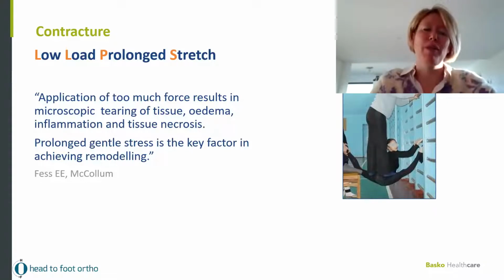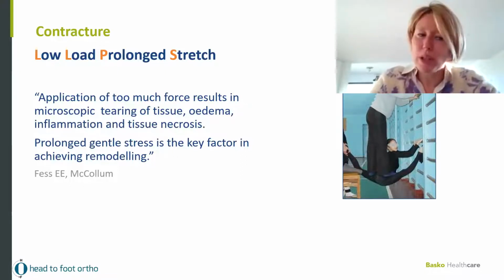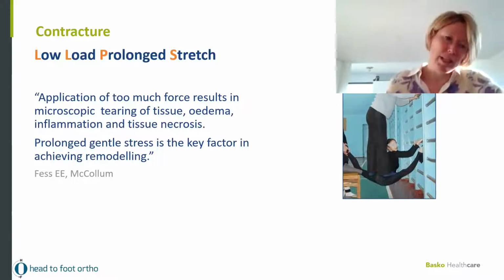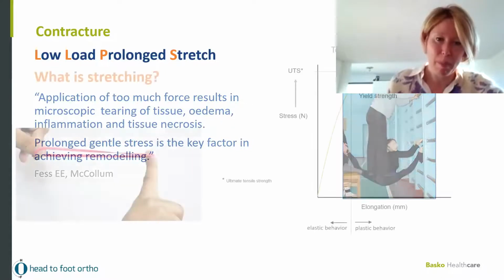This is a very important one, because if you apply too much force, it will result, and it's very logical, in microscopic tearing of tissue, oedema, inflammation, and even tissue necrosis if you put too much force on tissue. And it is said that prolonged gentle stress is a key factor to achieving remodeling.